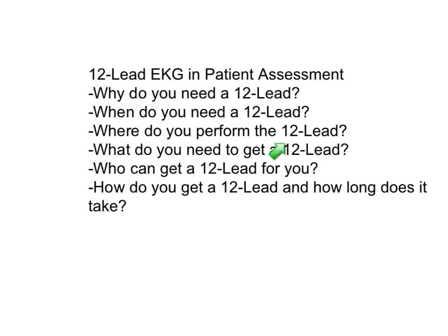What do you need to get a 12-lead? You need the standard limb leads in place, as well as the additional 6 wires for chest leads. And you need some good skin prep. We probably don't do very good skin prep. If you watch videos from Physio or from Zoll, they emphasize skin prep.